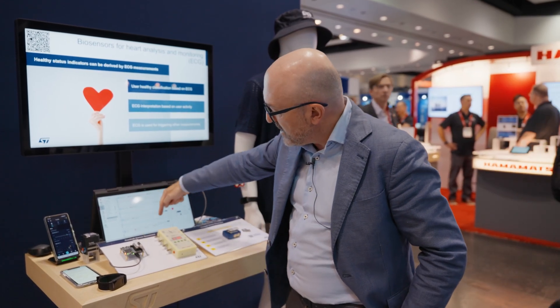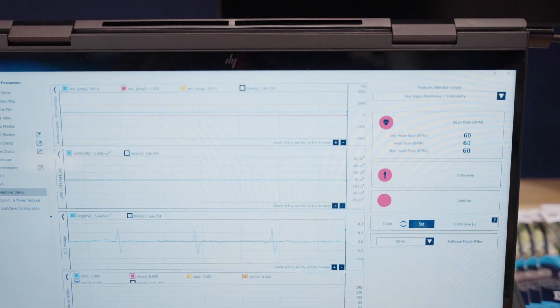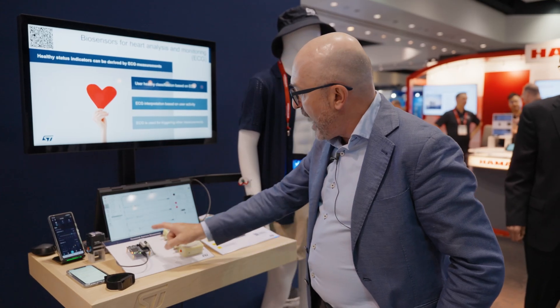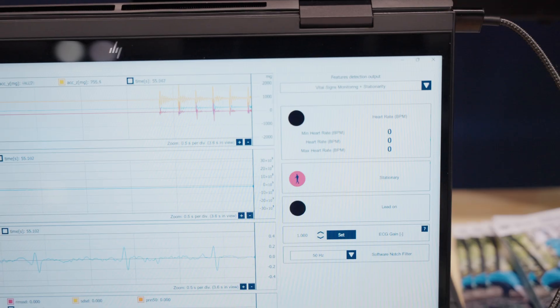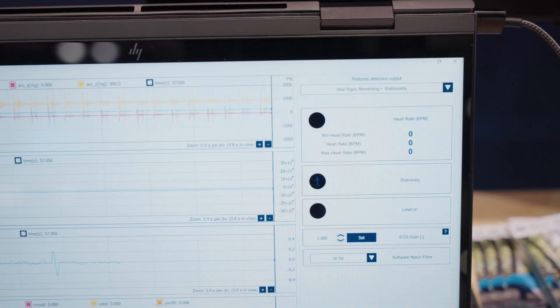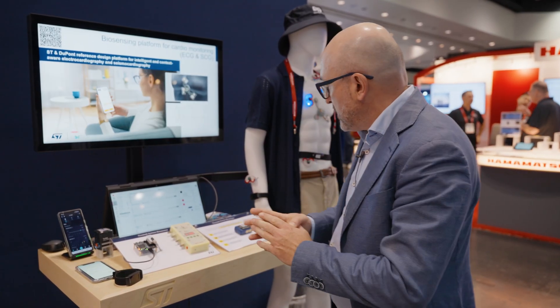Here we can see the signal for the R-Rate. The R-Rate has been generated from this emulator here, but if I'm moving the sensor, you can see it's not detecting the R-Rate anymore because the signal I can get from the R-Rate is not reliable.